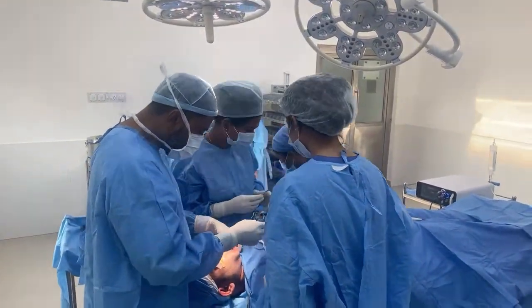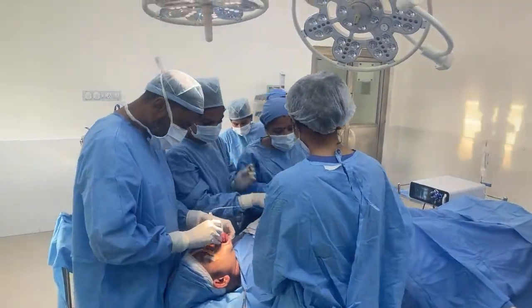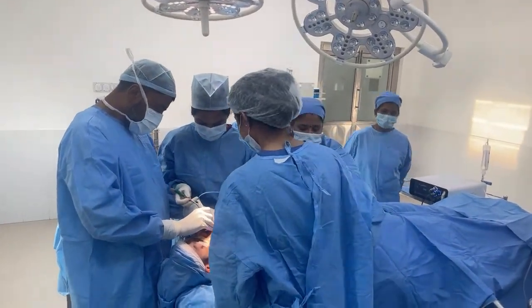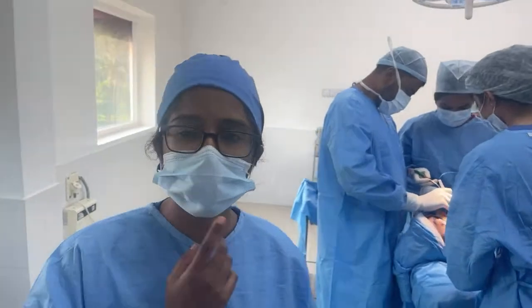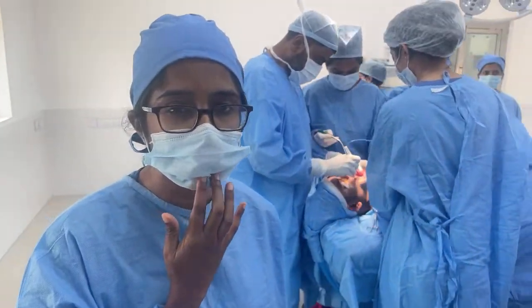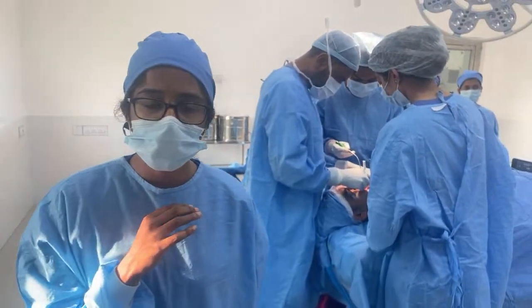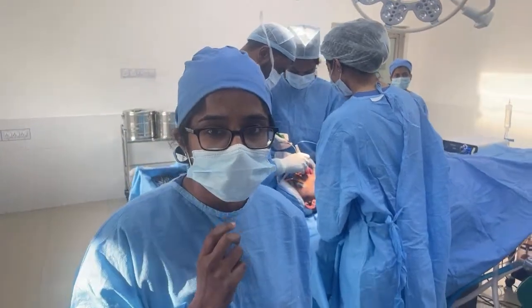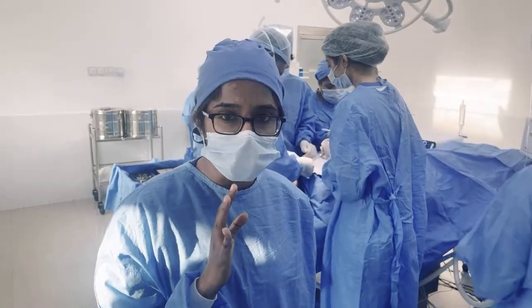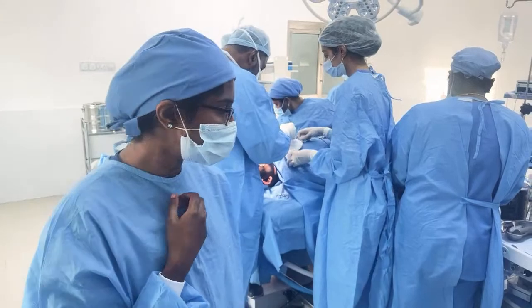As you see, we've finished the work on the angle region. Mind you, there are two mental foramens, or the mental nerve, which supplies the soft tissue over the chin and the lower lip. So we are being very careful about that, and the mental nerves remain intact during this augmentative procedure.